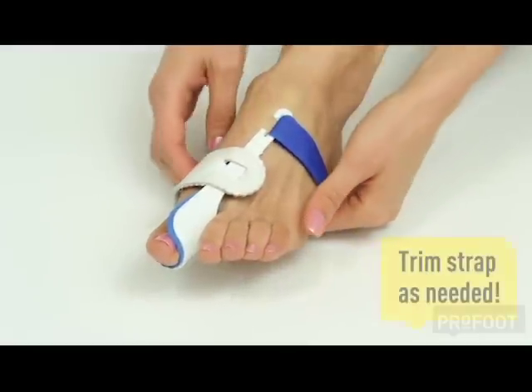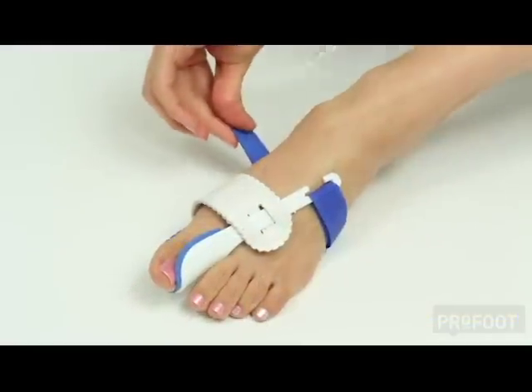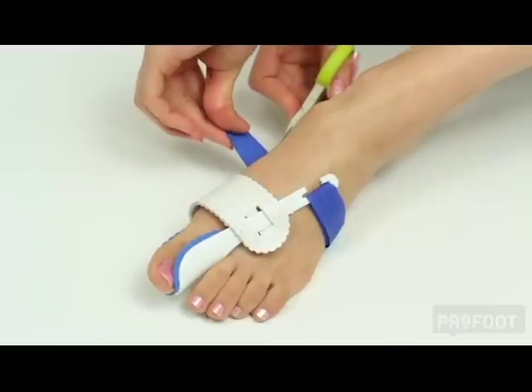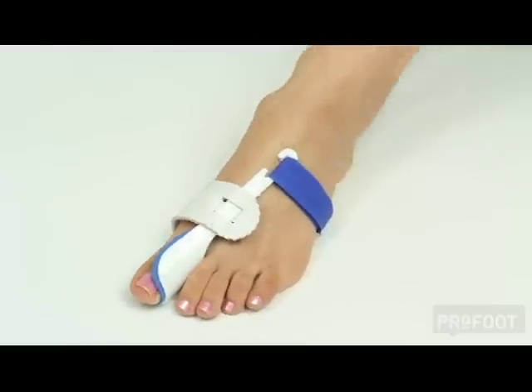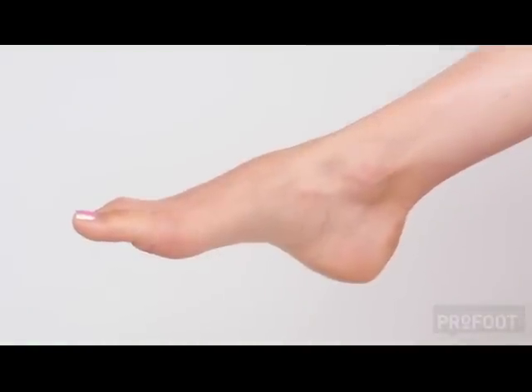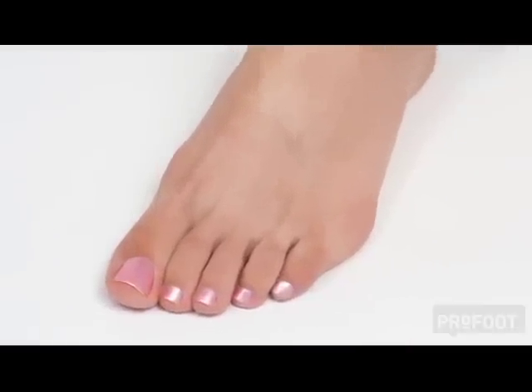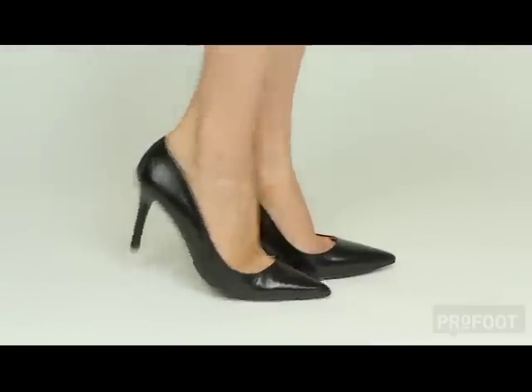Gently pull and fasten with the velcro closure. Trim the strap as needed. Increase pressure on the big toe over time by gradually tightening the strap and feel instant relief. Make a commitment to stop your bunions in their tracks and restore your foot to its healthy shape. Say goodnight to your bunions and good morning to relief.